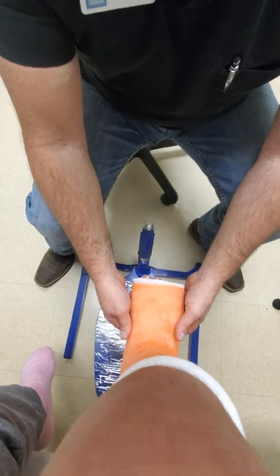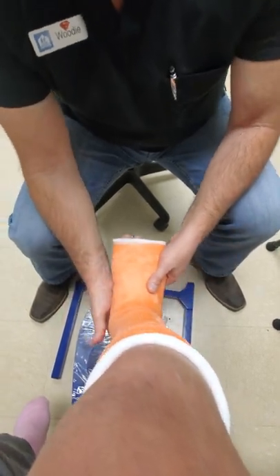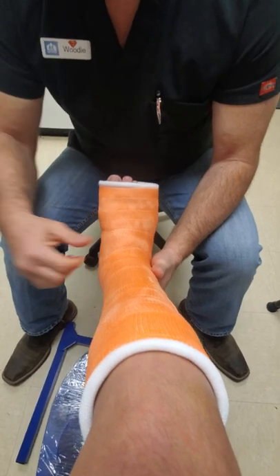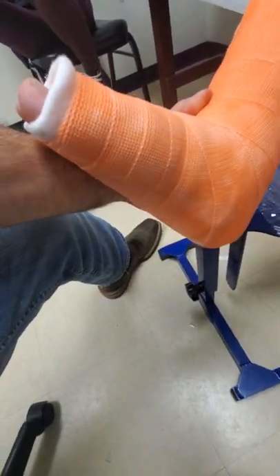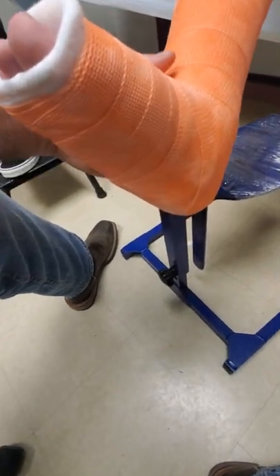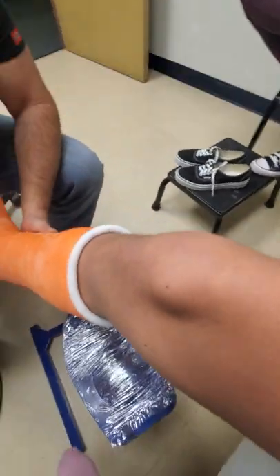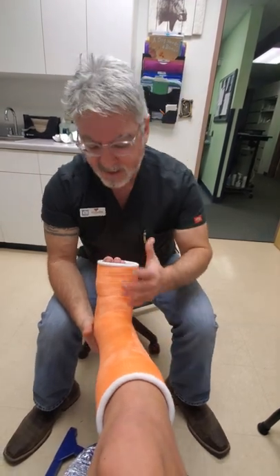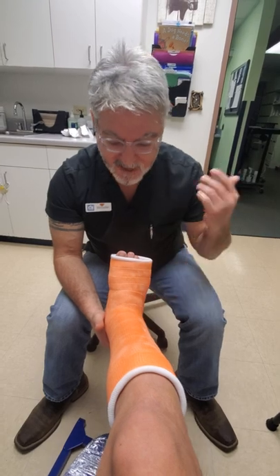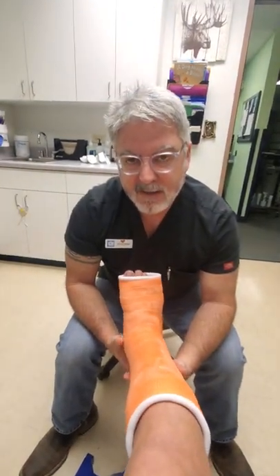The cast has had time to set up. By leaving the plastic wrap on there, the foot doesn't stick at all. You can see we have a nice right angle and a nice solid cast. Looking at the bottom, you can see a nice little curve — a natural arch right there. That completes our short leg fiberglass weight-bearing cast using the cast stand. The only thing we're not doing is putting the shoe on — you'd put the cast shoe on, strap it down, and have them walk out the door. If you have any questions or comments, let us know and we'll make more videos. Thanks very much.